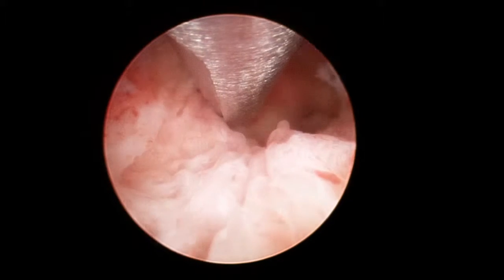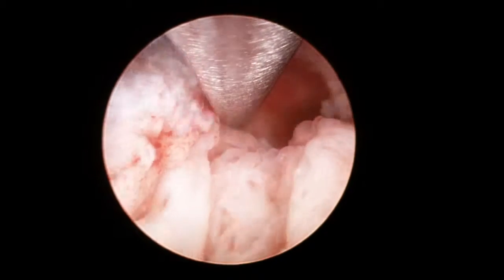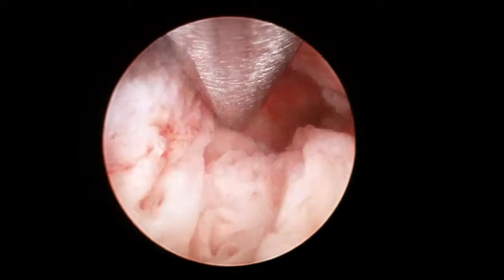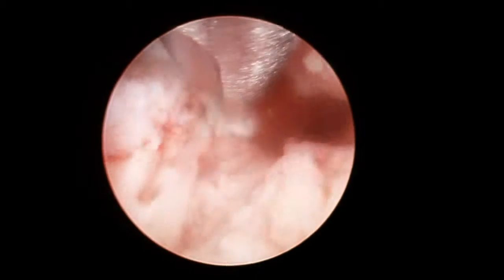This patient was treated with Cytotec 100 micrograms orally and 100 micrograms vaginally the morning of the procedure. No mechanical dilatation was used, since dilation may create false tracking into adhesions within the lower uterine segment or lead to leakage of fluid from the cervix if overdilation occurs.